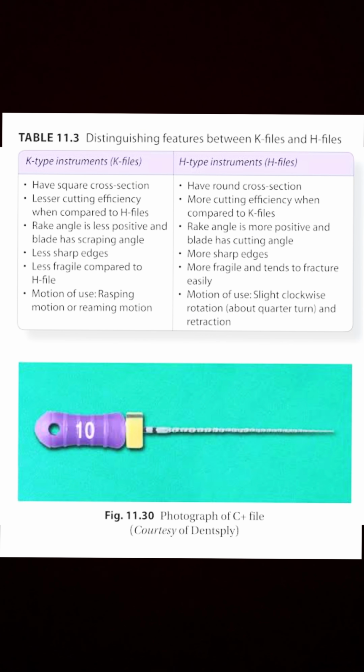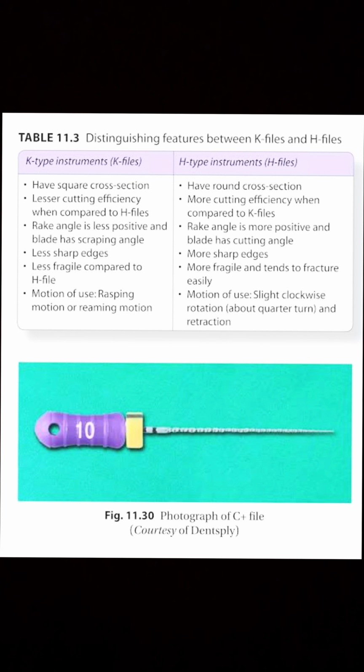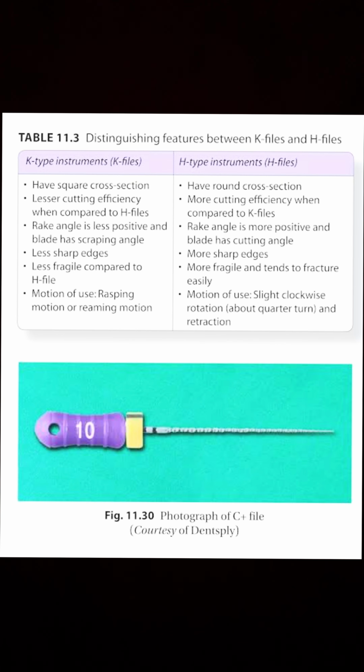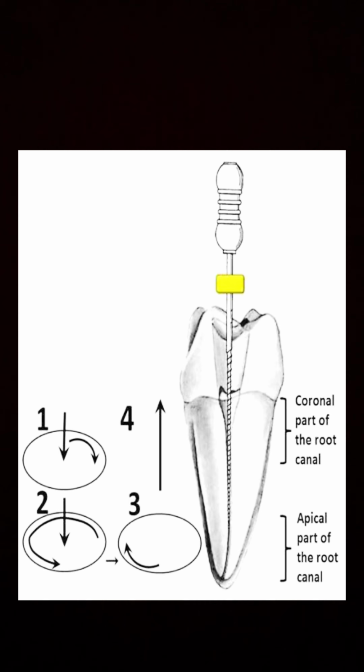Guidelines for shaping of a root canal. The tooth to undergo root canal therapy is identified by penetrating the enamel at the site of the access cavity. The rubber dam is applied. The tooth clamp and rubber dam are scrubbed with a sterile cotton tip applicator. The access preparation is completed in posterior teeth.